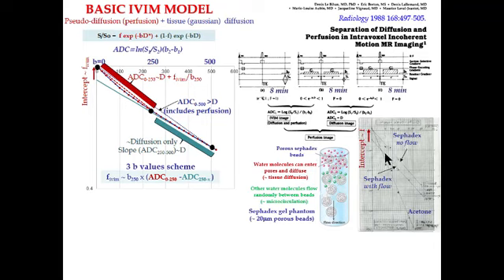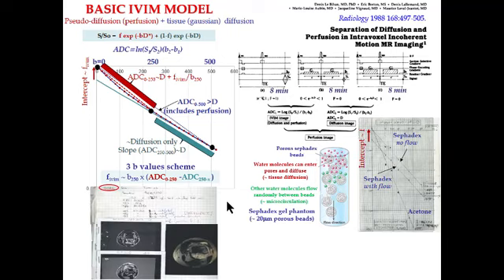So this would be the pure diffusion. In the presence of flow, you see that we get a deviation here and an intercept. And we could show that, yes, in fact, we can measure the perfusion, the flow of water, with this method. I don't see well, but I think it's maybe 1986. So these were the very first images showing diffusion and perfusion IVIM maps.